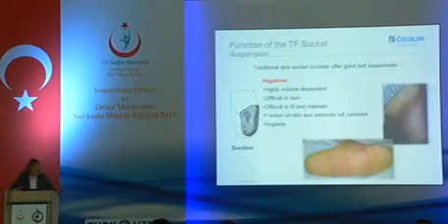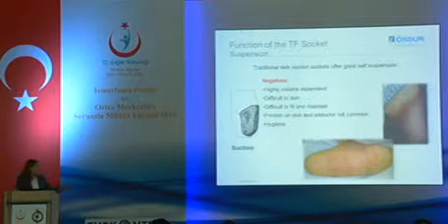You can get a lot of friction on the skin, not only from the rigid socket, but also from the bandage.